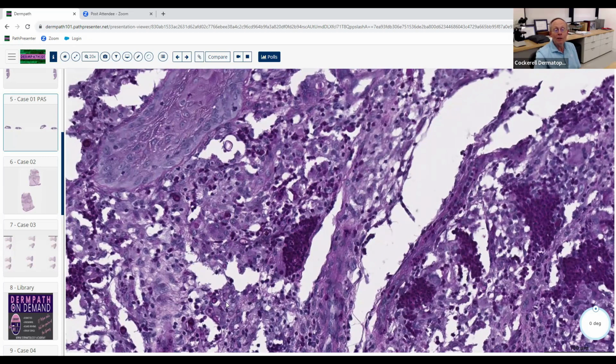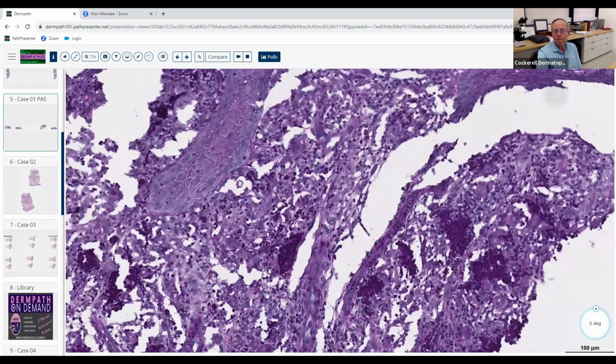It's early in the game here for you guys, but here's another one right there. You definitely are going to see infections because, first of all, no one can say, well, it's something else. It's pathognomonic when the organisms are present in tissue, and they want you to be able to recognize these organisms and know the various patterns. Like in cocci, for example, the barrel-shaped arthrospores that you see in the mariner's wheel type of things that you see when you get them in culture. So make sure you know those deep fungal infections.